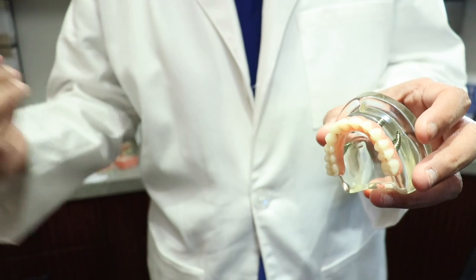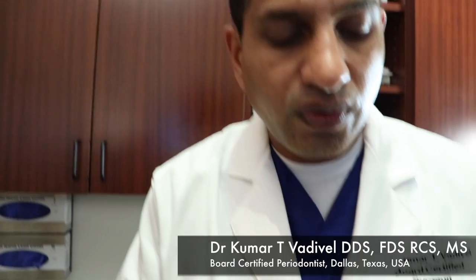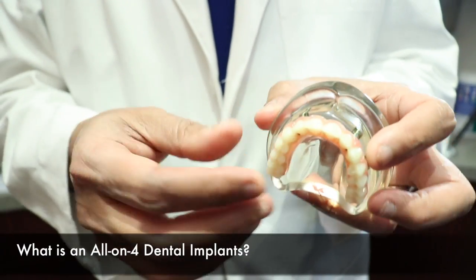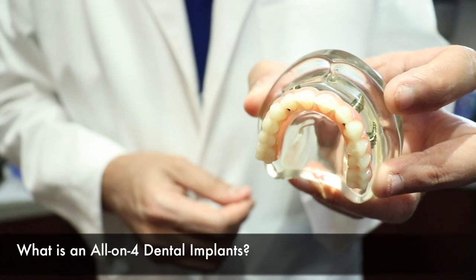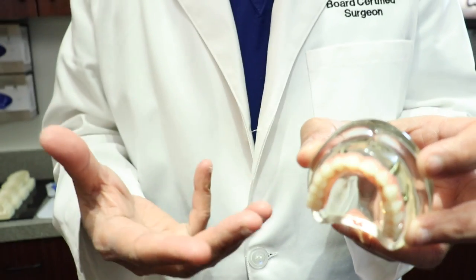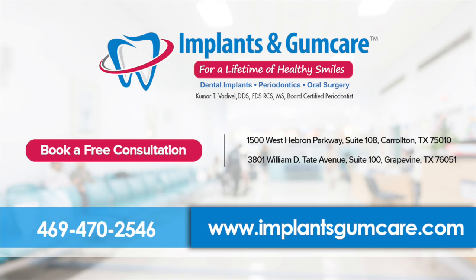This way, the fixed prosthesis sits on just four implants instead of six, and you don't need bone grafting. You still get a fully fixed set of teeth. Additionally, these teeth can be placed on the same day as the extractions and implant placement — and that is what is called an All-on-Four dental implant.